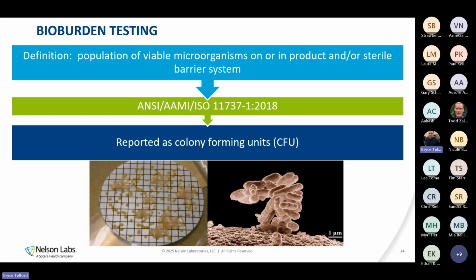And we'll clarify here, since we are talking about sterilization or sterile barrier system, sometimes we're considering just the sterilization of an individual product. Sometimes that might include everything within the sterile barrier system. So your sterility claim, where the sterility claim is on your sterile barrier, and what's being claimed as sterile all need to be considered.